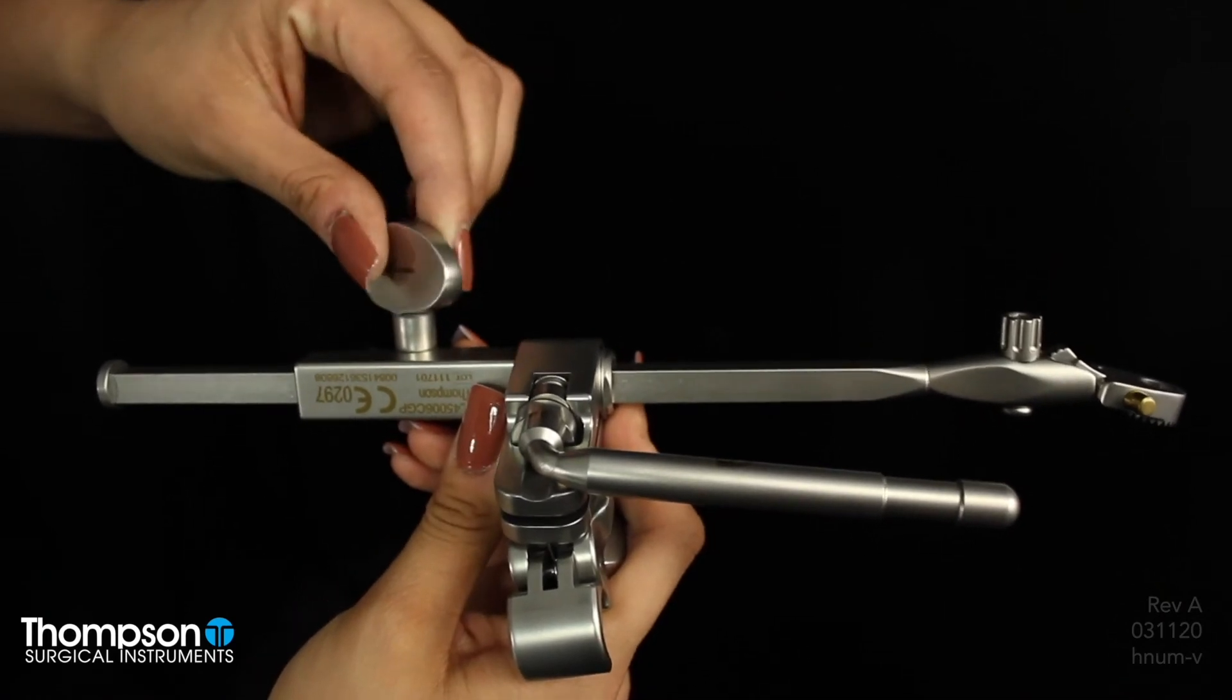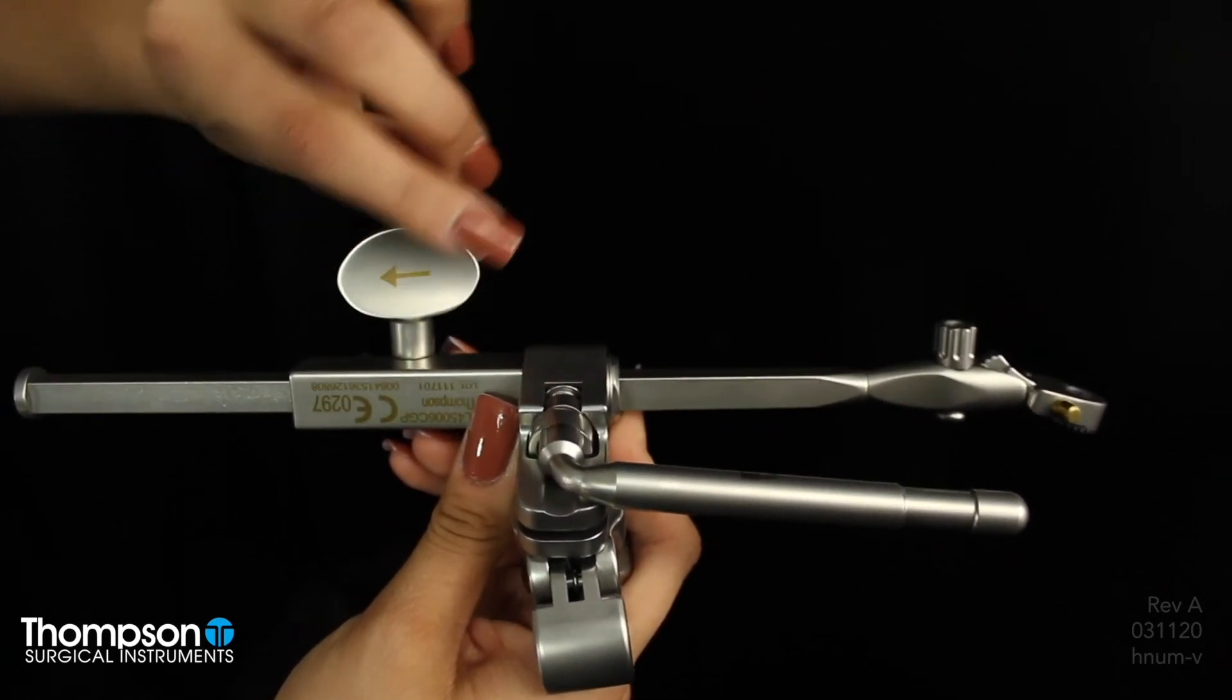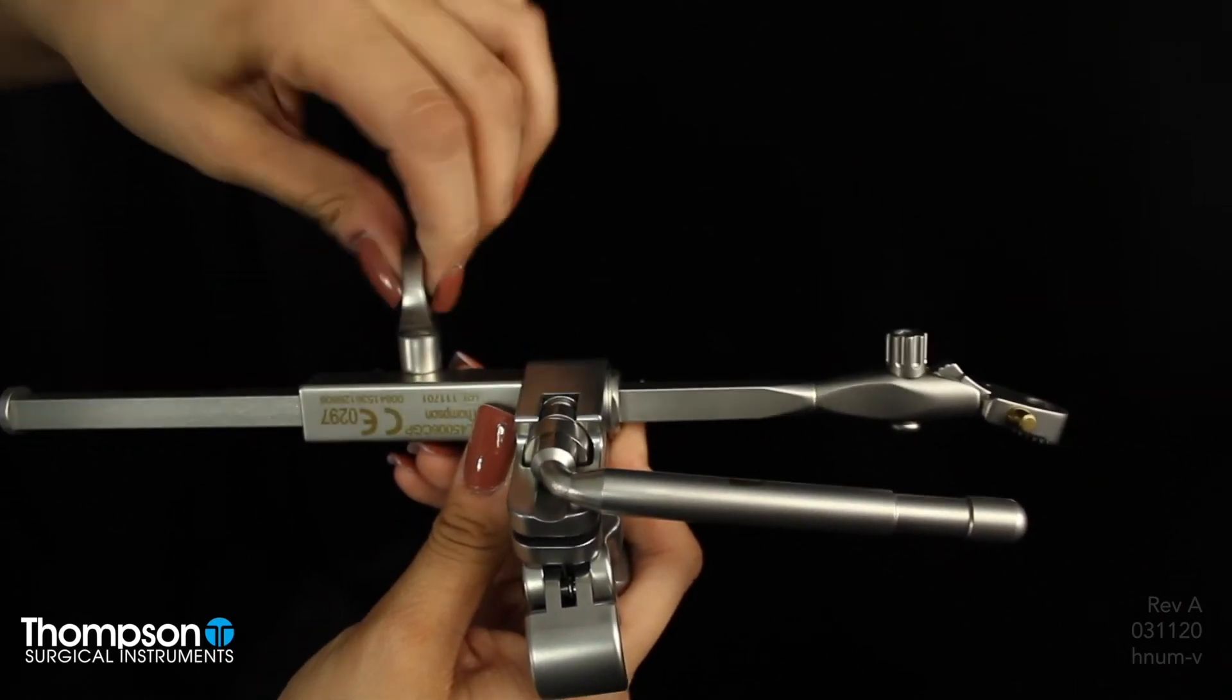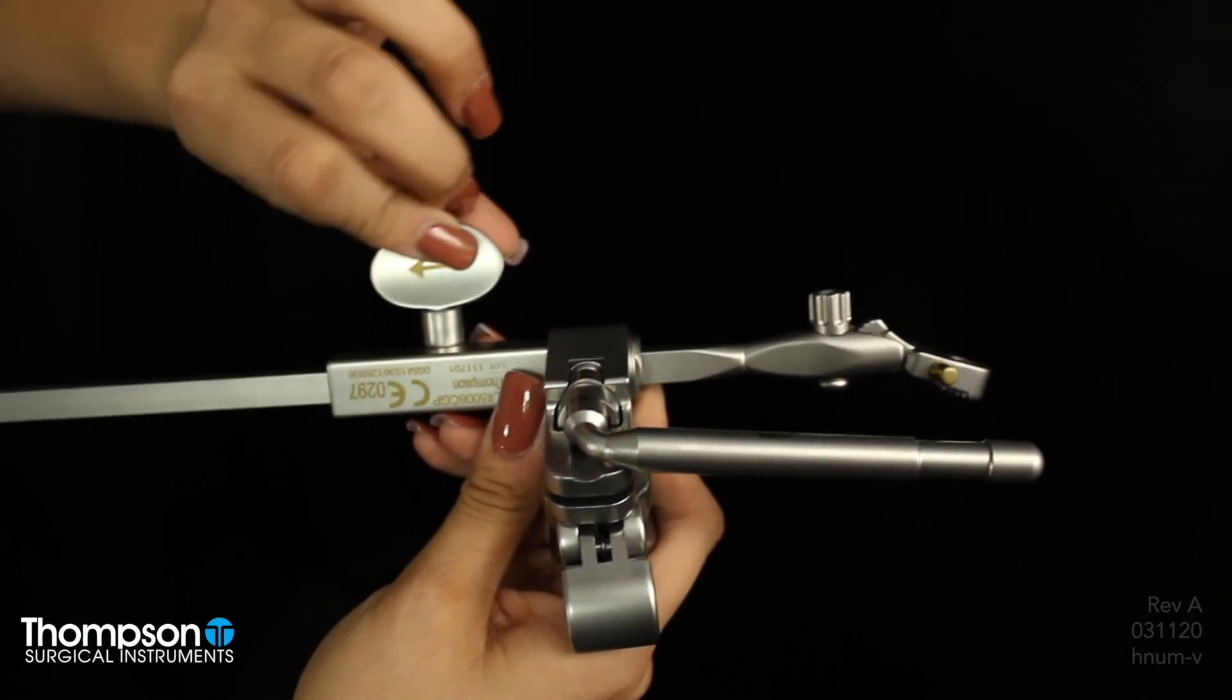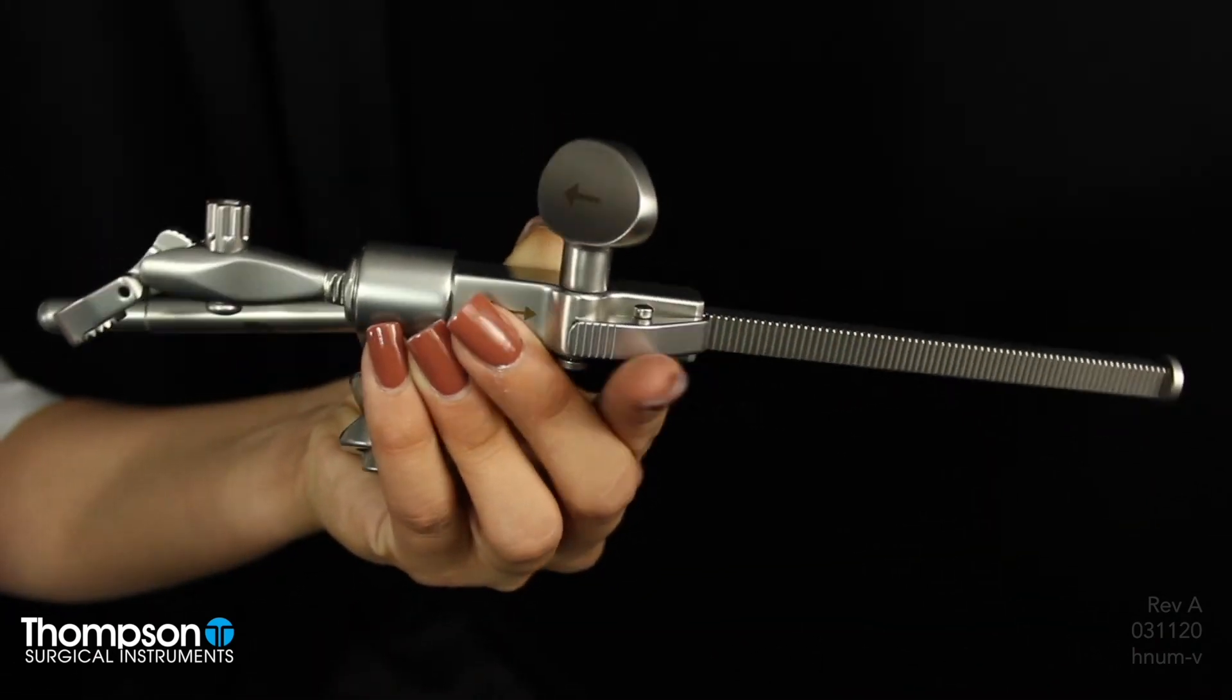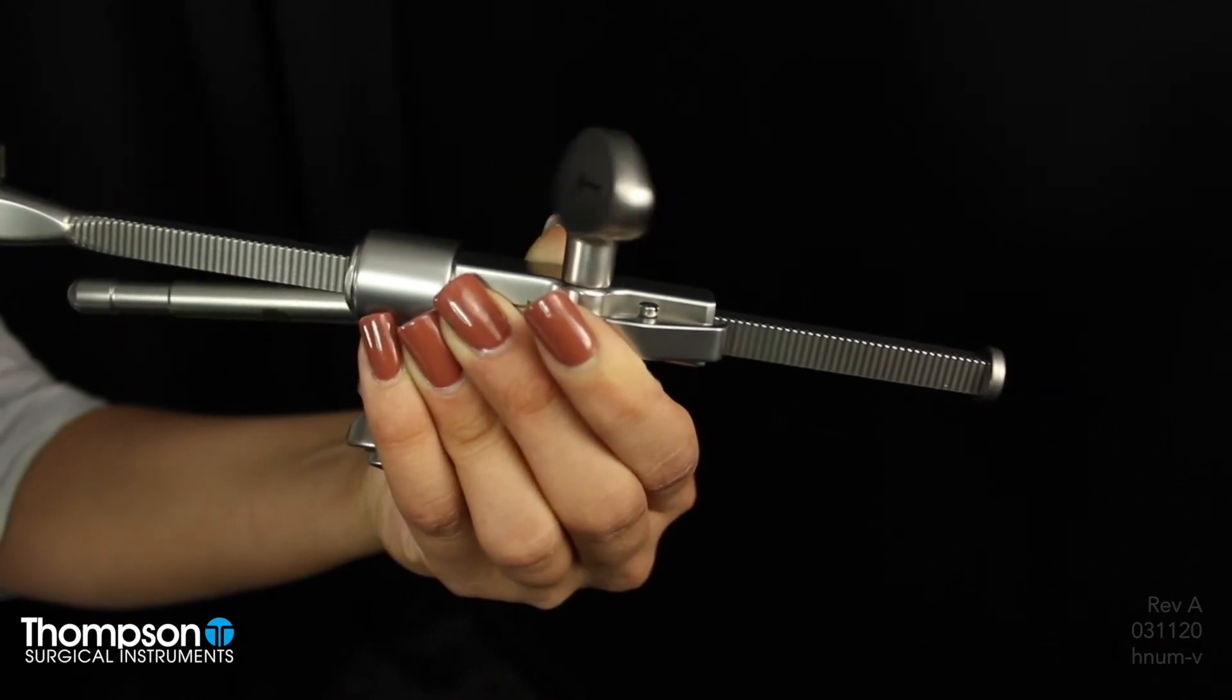Our micro-adjustable handles provide precise micro-adjustments to the blade after retraction is in place by simply turning the micro-adjustable knob to retract further. To release, simply press the pawl.